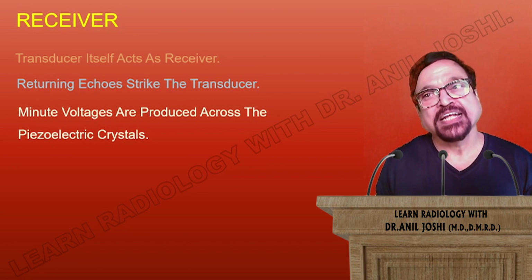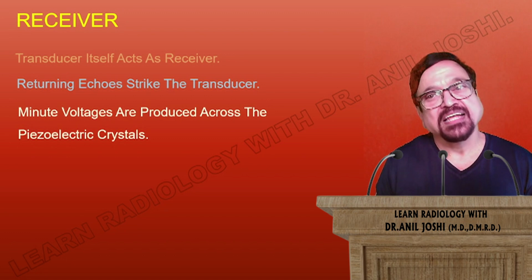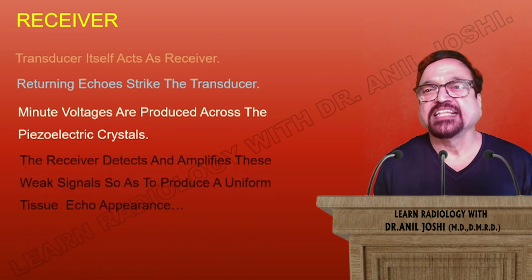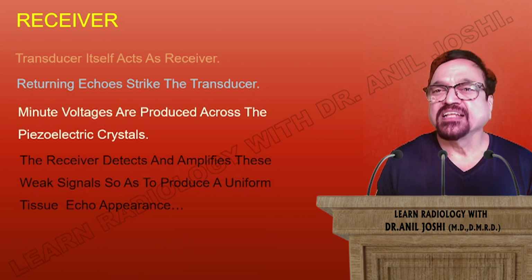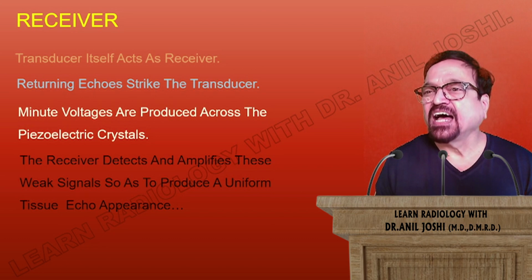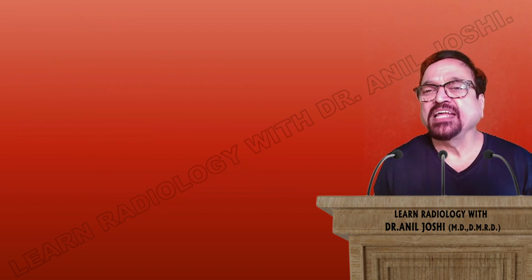So the transducer itself acts as the receiver. Returning echoes strike the transducer. Minute voltages are produced across the piezoelectric crystals. Then these received waves or signals are fed to the amplifier and then to the monitor.